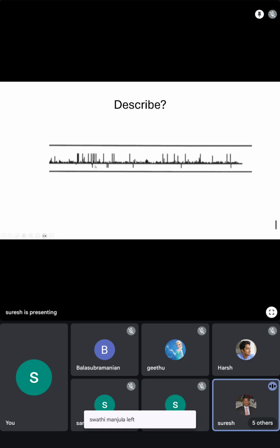The lower deviation happens whenever he is blinking. So whenever you are looking at the gaze tracker and you see more of lower deviation, don't ignore that. It simply means he is blinking. Whereas if you have frequent upper deviations, that means it is not reliable. There is a very large amount of fixation losses. Okay.